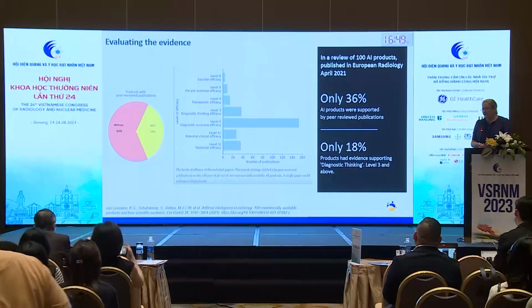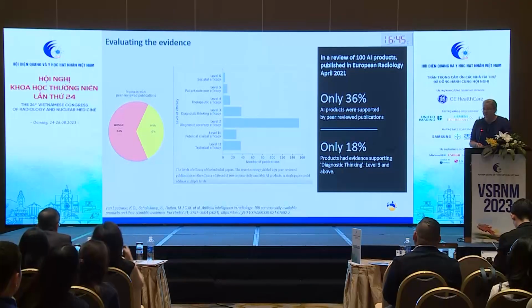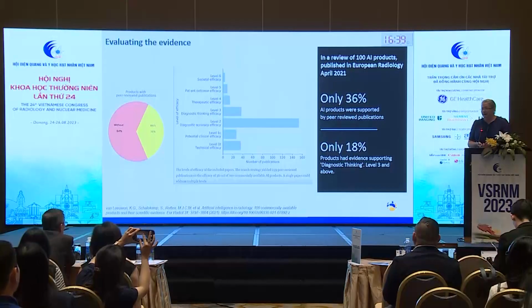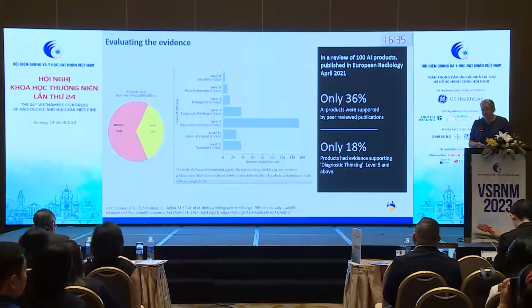Unfortunately, there's not a lot of evidence for many of the AI products that are out there. Only 18% of AI products published by April 2021 had any evidence about how the AI changes the radiologist's performance.